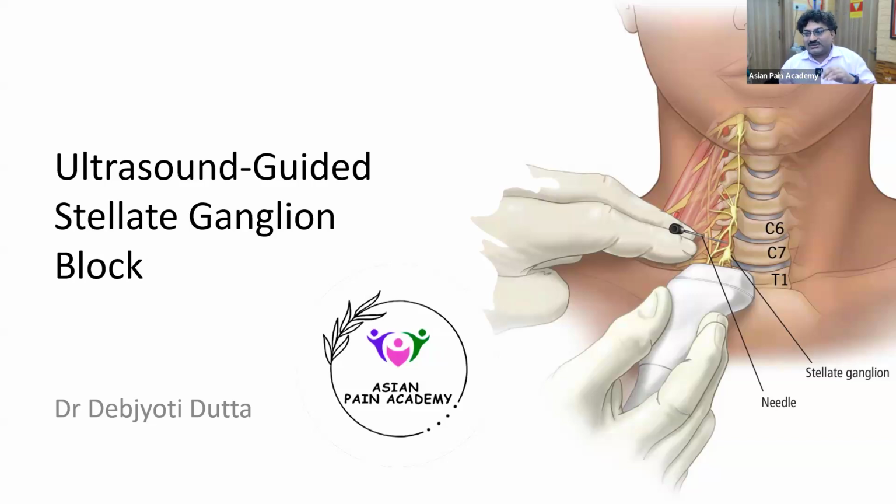In fact, since ultrasound came, for maybe the last 5 years, I have not used the fluoroscopy guided stellate ganglion block, because ultrasound gives good visualization of the nearby structures. It gives a very good view of the vessels. That is most important. That is why we can directly go above the longus colli, either at the level of C6, or here is the big advantage.